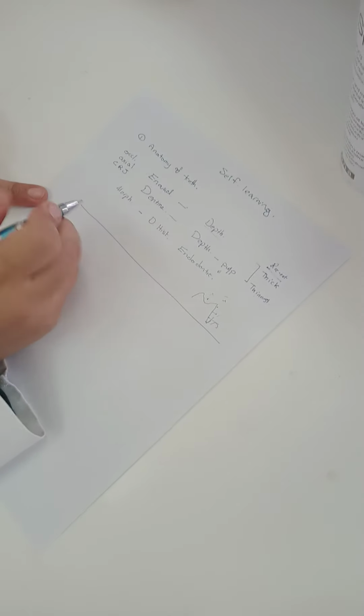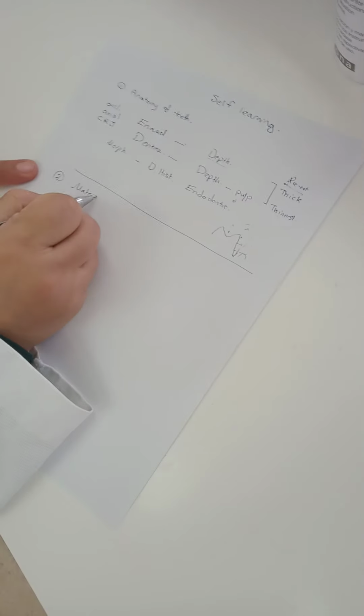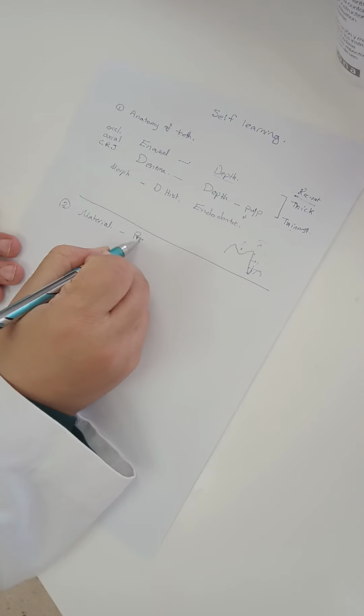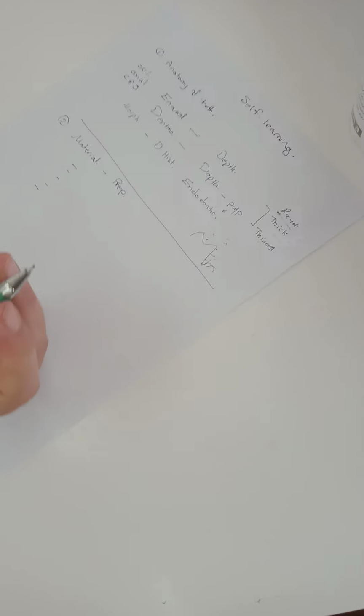My second task is material. How does my preparation get affected by the material? How do I change my preparation based on material? What are the materials available for crowns? You're going to name them: metal, PFM, zircon, E.max, for example.